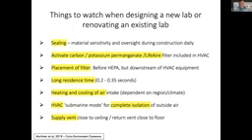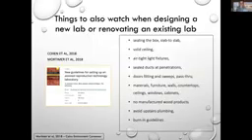The HVAC submarine mode is something that has been proposed, so that if there's an incident outside, such as that tarmacking incident in the 1990s in Maryland, you want complete isolation of outside air. That can be achieved by being aware during the planning and construction. The supply vent should be close to the ceiling and the return vent close to the floor. There are other things as well that did not necessarily come up in this consensus meeting.